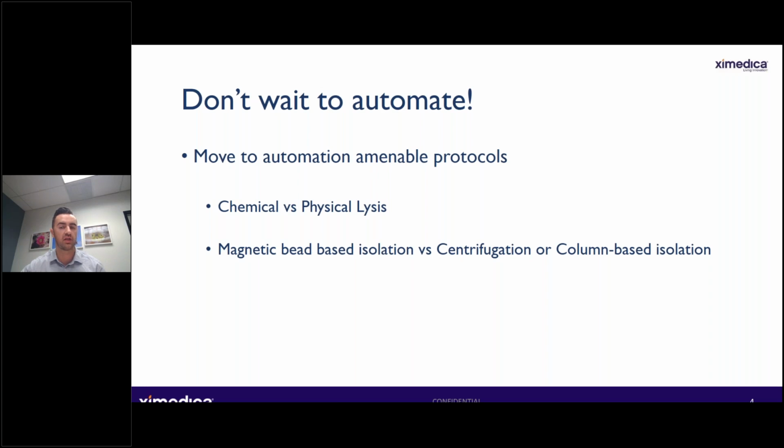And looking around everyday life, more and more automation is being implemented, and it's easy to see how slightly different approaches were taken to everyday tasks in order to enable this automation. If we look at a dishwasher, for example, it dries your dishes at the end of the wash, and it does that by using heated air. They didn't try and automate using a kitchen towel to dry the dishes. So the same lesson applies to automation for diagnostic instruments. An approach that may work well in a manual fashion may not necessarily be the best approach for an automated instrument.